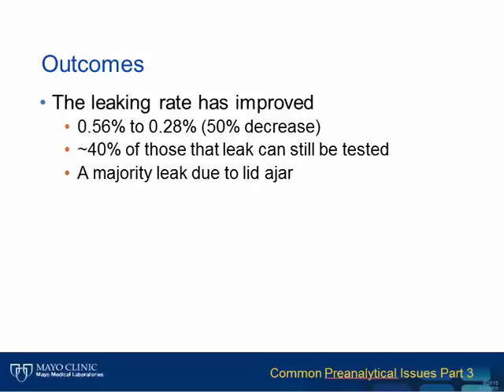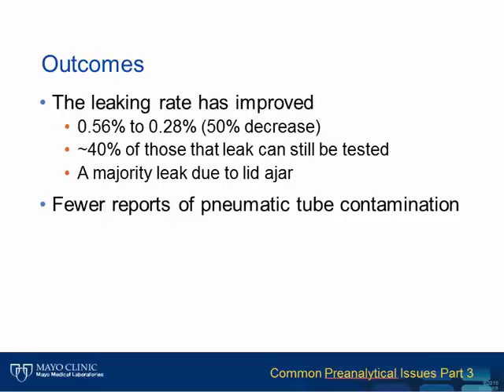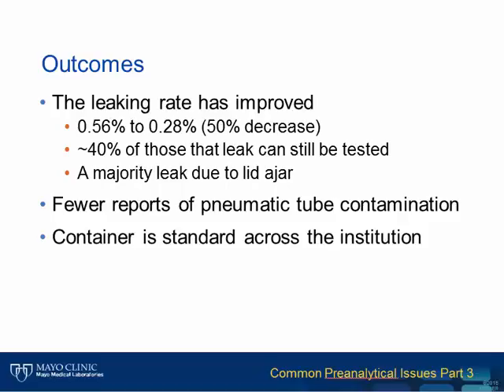Ultimately, the leaking error rate improved by 50%, with many still being able to be tested, noting lid ajar as the primary cause for leaking. Fortunately, the leaking that did occur did not leave the biohazard packaging in most cases. And the container has been standardized across all areas, simplifying purchasing and cost savings.